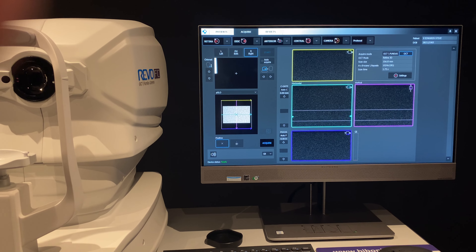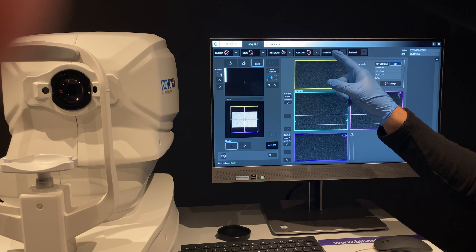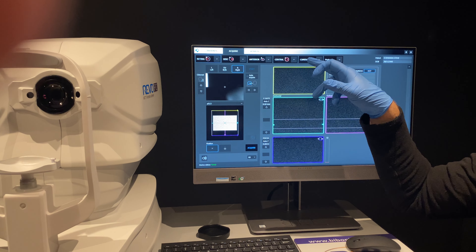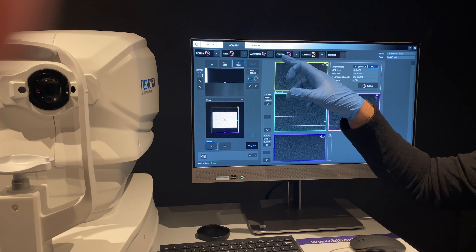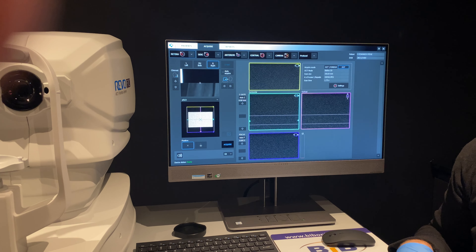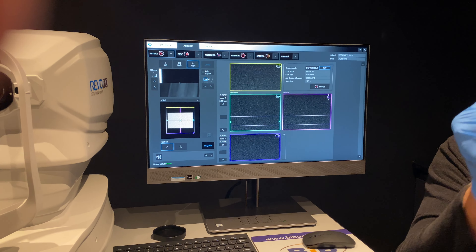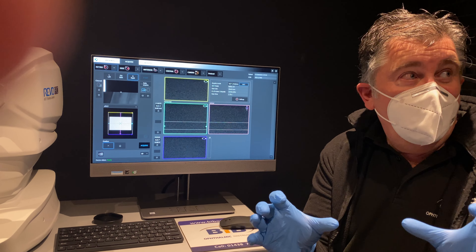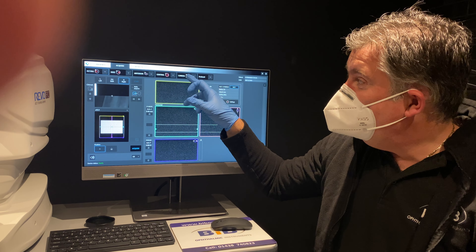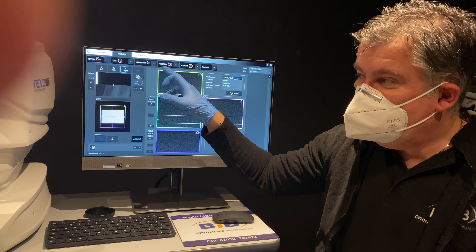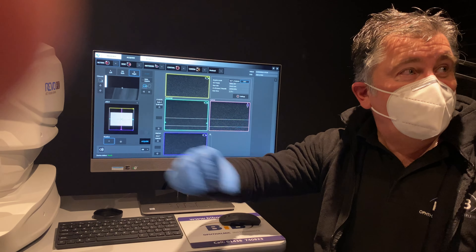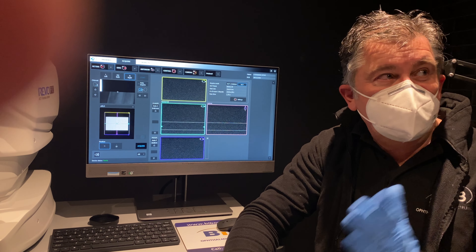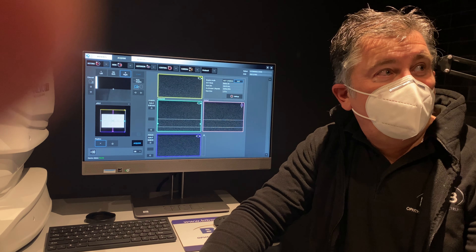Typically, would you start with fundus photography and then go on to OCT? A lot of people will do one eye fundus photograph — say the right eye — then do all their OCT scans, then do the left eye fundus photograph. The problem with flashing is that as soon as you flash the patient their pupils constrict, so it's very difficult to do right and left fundus photographs one after the other. You've got to give the pupil a chance to open up. Also, with fundus photography you always get what's called second eye syndrome — your second image is never as good as your first.